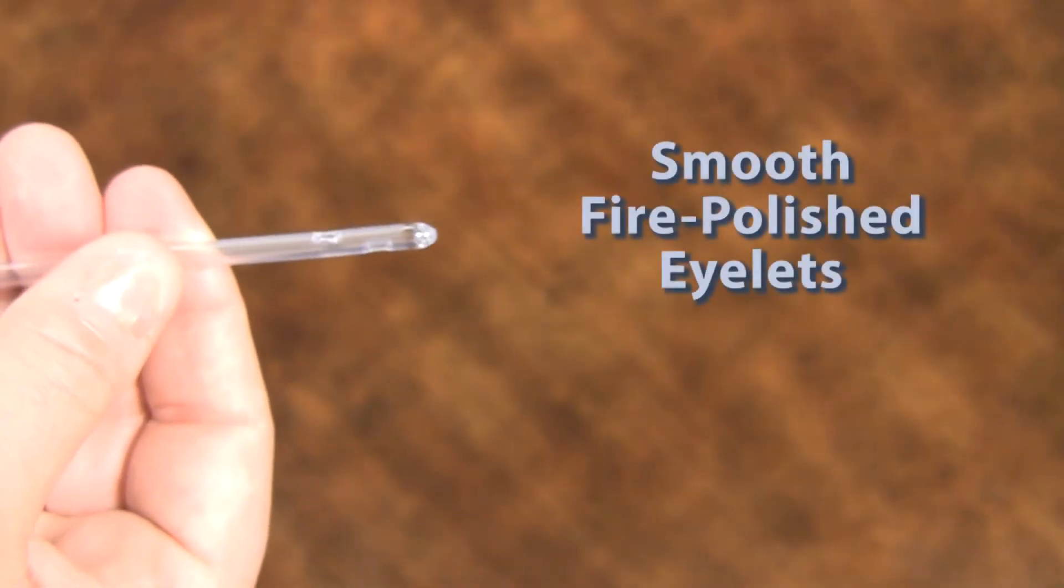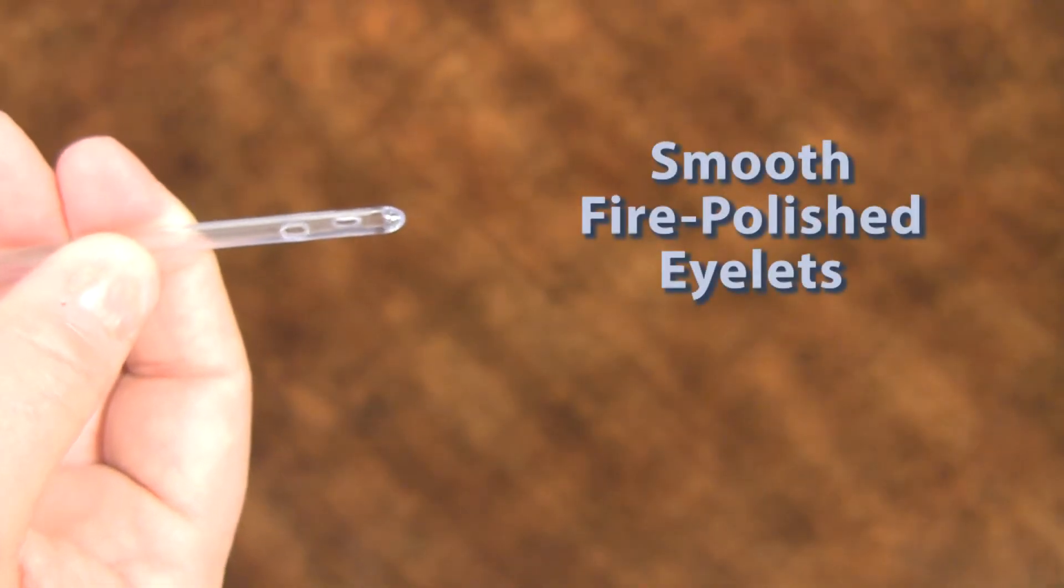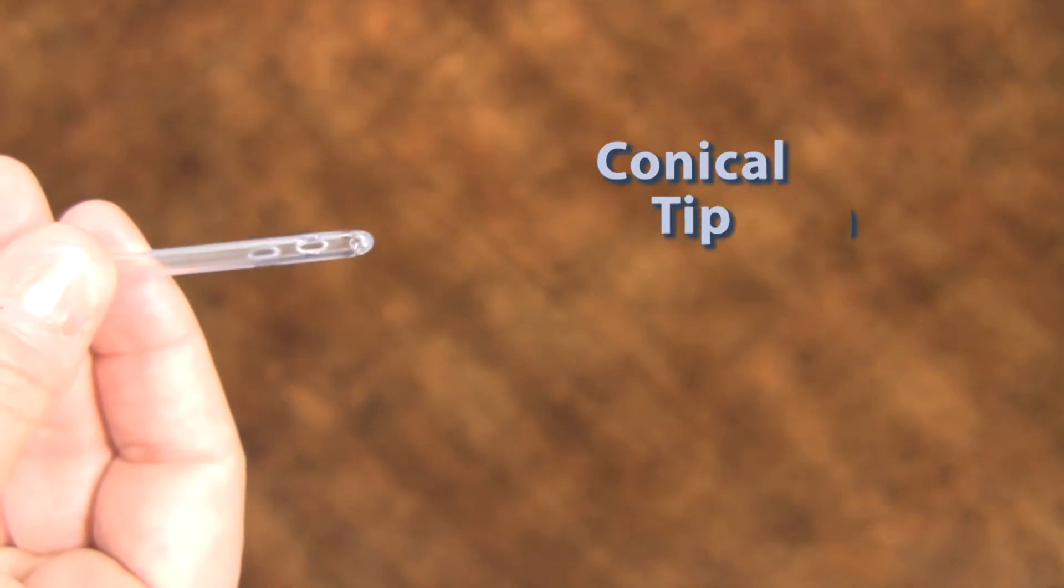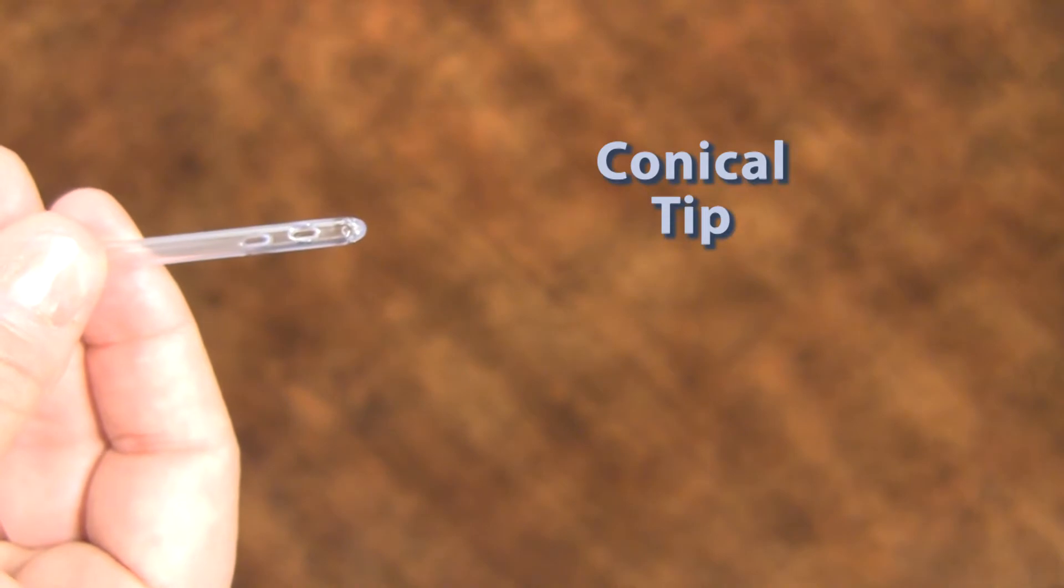MTG's catheter eyelets or drainage holes are fire polished so they're less likely to cause irritation as the catheter winds its way through the urethra. We also have a conical tip which helps the catheter pass tight spots along the way.